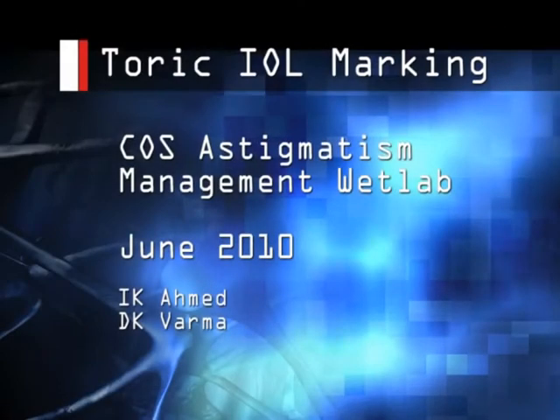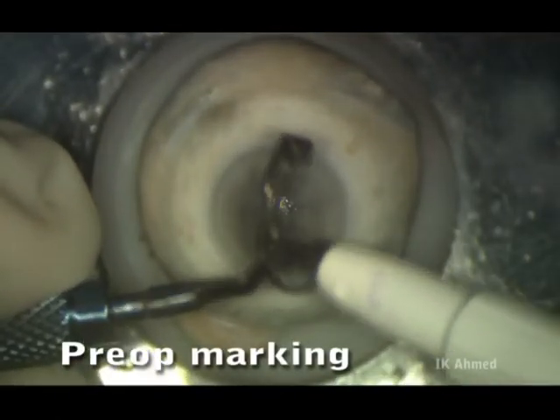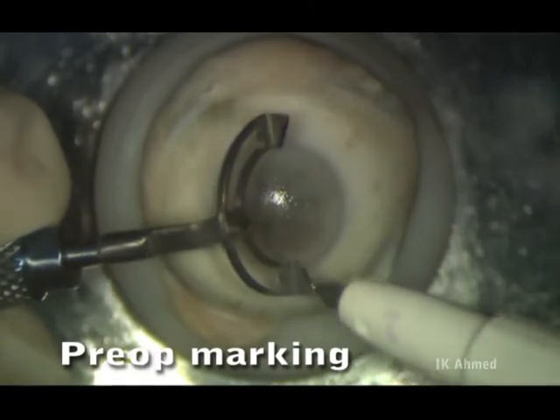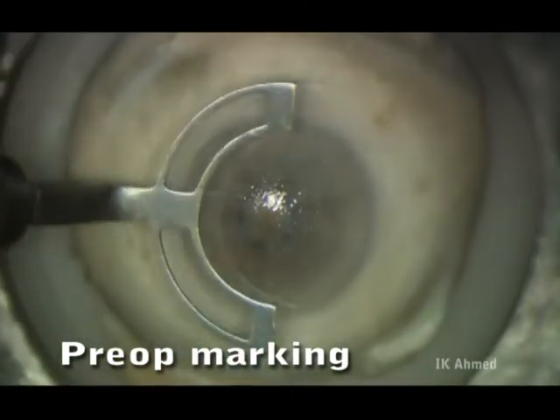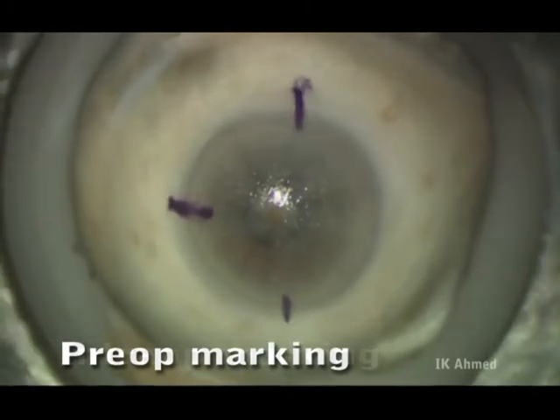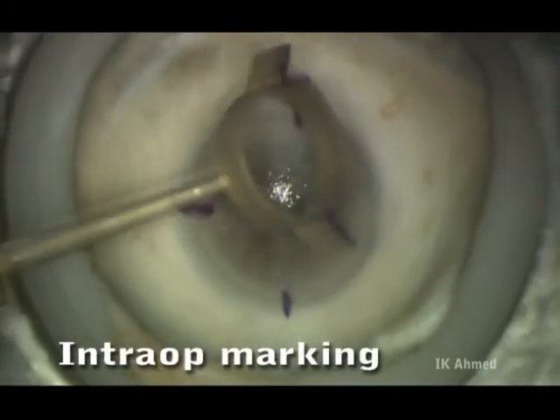Next, we'll practice marking for toric intraocular lenses. Here we're preparing a three-ray marker by using a marking pen. This will be used preoperatively with the patient seated upright. Typically, we'll mark the horizontal and six o'clock positions.